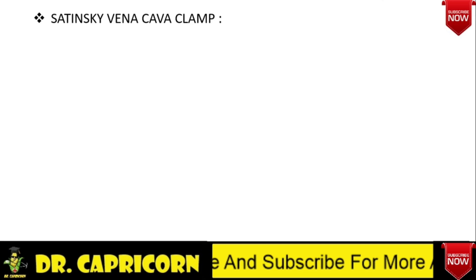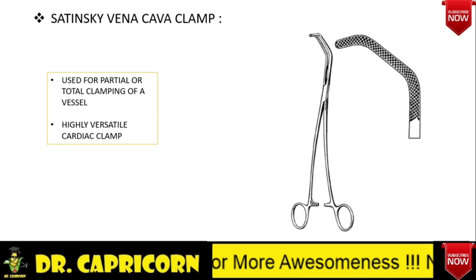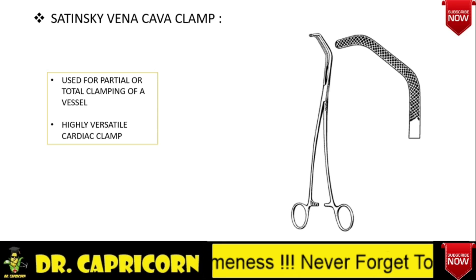Lastly, Satinsky Vena Cava Clamp. Note the particular shape of the blade and criss-cross serrations. It is used for partial or total clamping of a vessel, generally the vena cava. It is a highly versatile cardiac clamp.